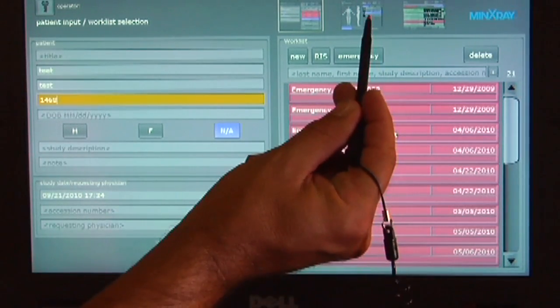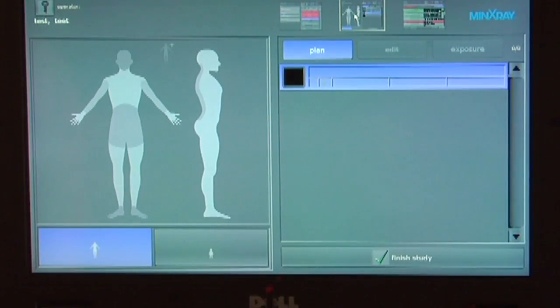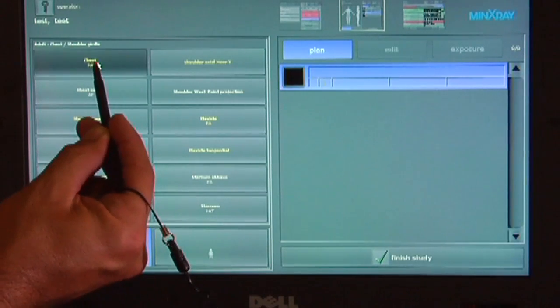Select the X-Ray tab located in the upper right corner of the screen to begin the X-Ray plan. Select the anatomy to be imaged on the adult or child model on the left side of the screen. Multiple exams can be selected before taking an exposure.